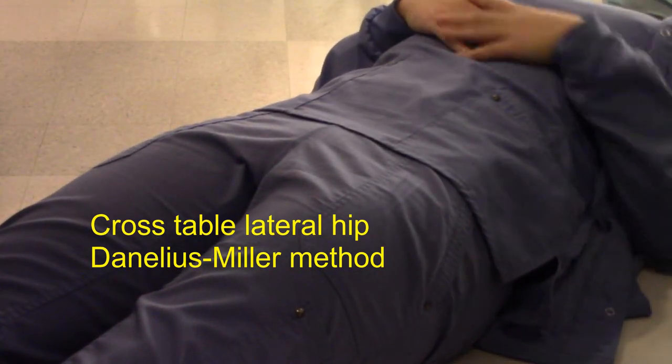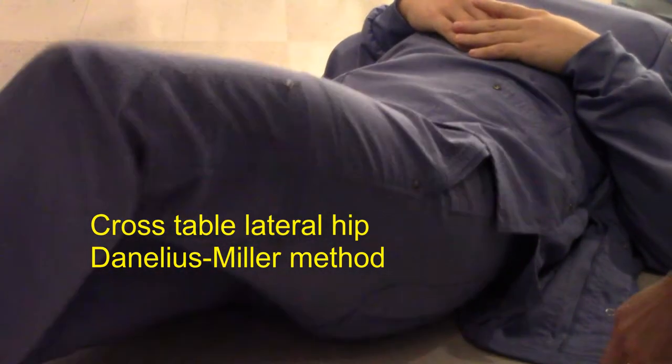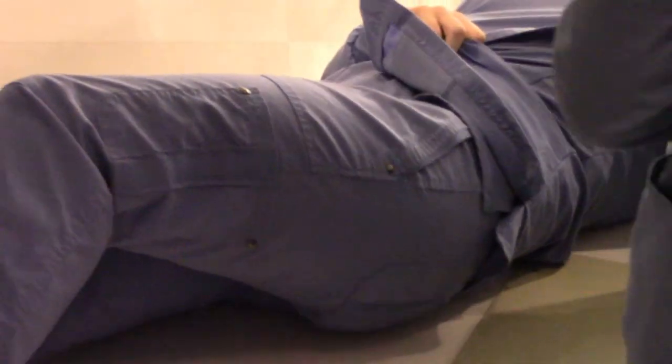Alright ladies, walk me through what we're doing here. This is supposed to be a cross-table lateral hip. What's the other name for this thing? Something starts with a D — kind of like Danielius. If I can't pronounce it I'd just go with the letters. Danielius Miller cross-table lateral hip.